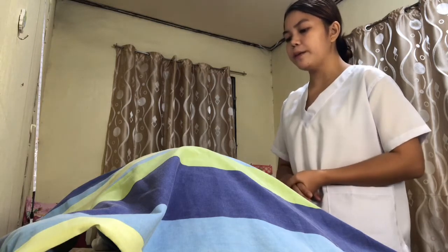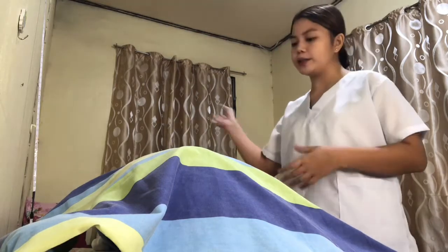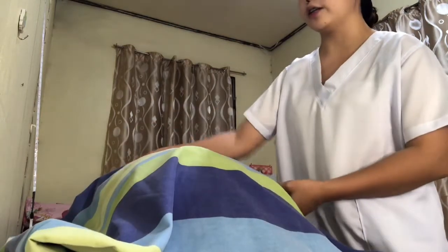Okay, thank you. So after that, provide privacy by screening or closing the room. So now I close the windows, ma'am, as you can see. This is to ensure privacy. We will position the patient in a dorsal recumbent with the knees flexed for easy visualization of the meatus. So we will now position you, ma'am, in a dorsal recumbent.